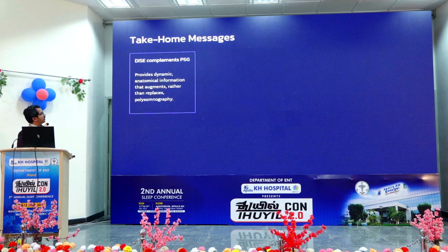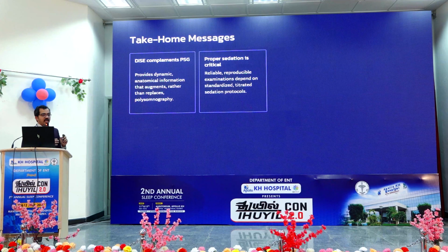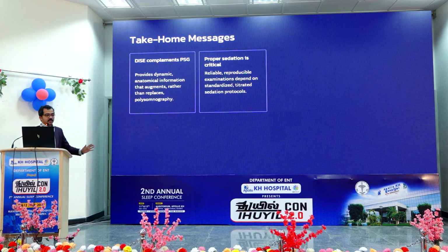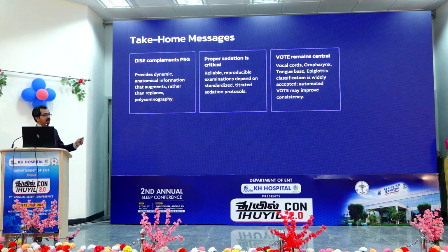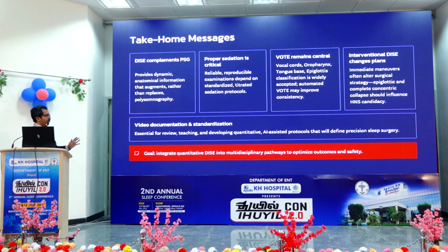So the take home message is DISE complements PSG. It is never a replacement for your PSG. Prior to doing a DISE, you should have your PSG. Proper sedation with target controlled infusion and with a BIS monitor is mandatory. Currently VOTE remains the central system for scoring the DISE, and with interventional DISE, if you do, you can change your surgical plans. Video documentation should be standardized.